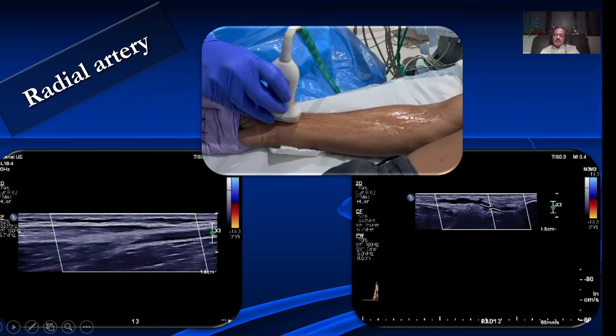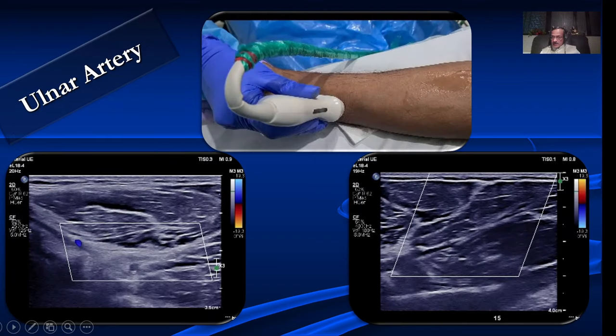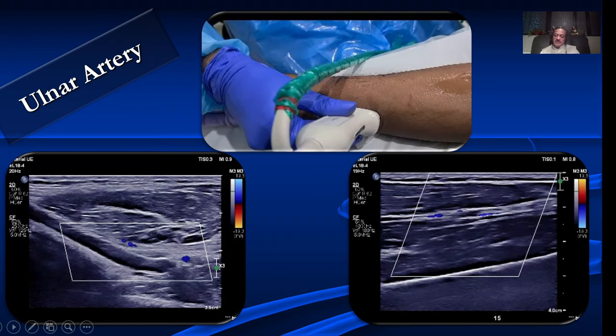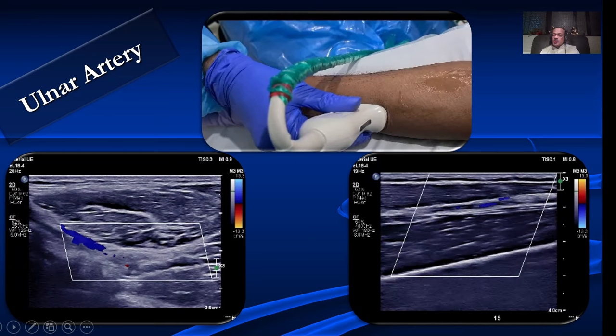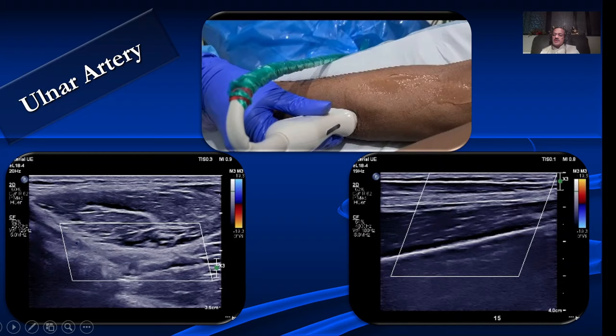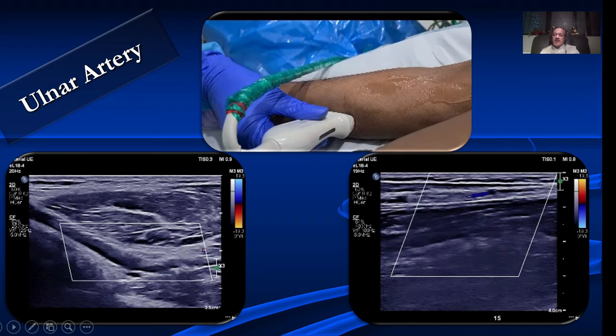Then we look at the ulnar artery. The ulnar artery dips down and the mid portion is very often difficult to see, but once you come closer to the wrist, the ulnar artery becomes superficial and again it becomes easy to evaluate.